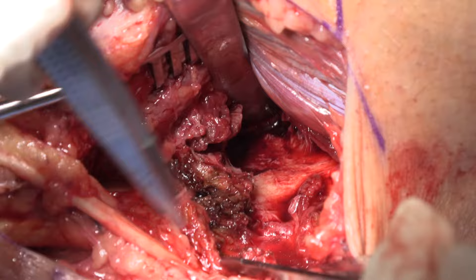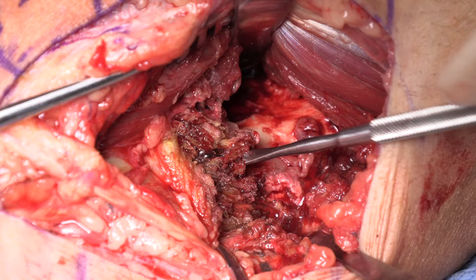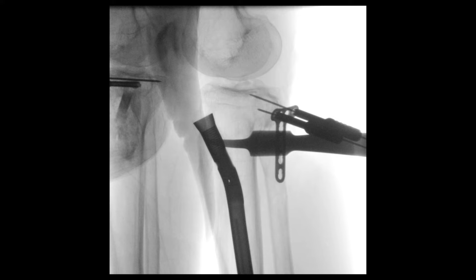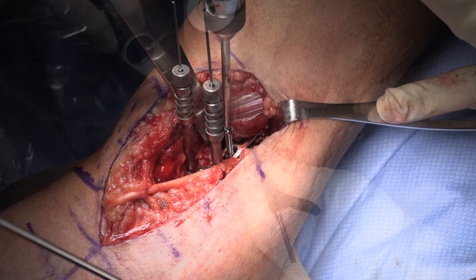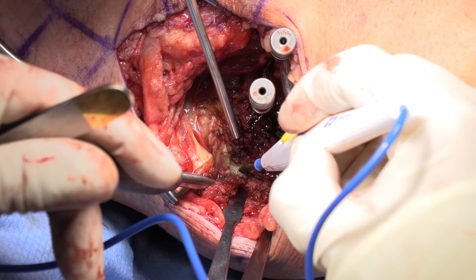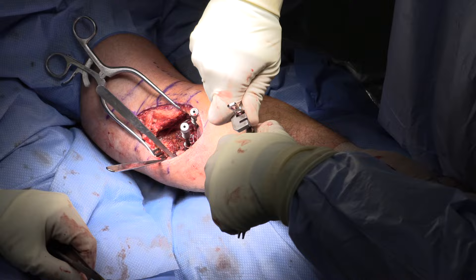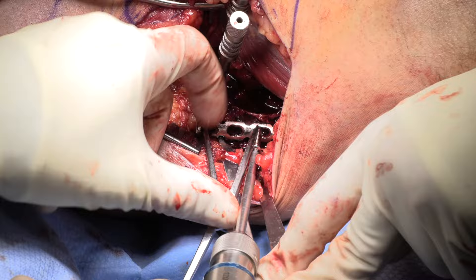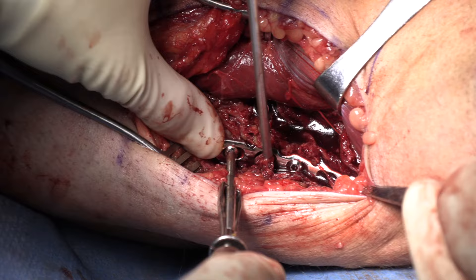Attention is first turned towards buttressing the posterior medial fracture. After reduction of the fragment, a 4-by-3-hole T-plate is placed on the posterior medial aspect of the tibia in a buttressing fashion. This plate is held in place by K-wires and reinforced with a 3.5 mm cortical screw. Attention is then turned to the medial fragment; the periosteum is elevated, exposing the fracture, and a 6-hole Recon plate is contoured and applied in buttress fashion. The plate is then fixed with 3.5 mm cortical screws and fluoroscopy is used to confirm reduction of the medial plateau. Care was taken when placing these two medial plates to not place fixation into the lateral plateau, which was not yet reduced.